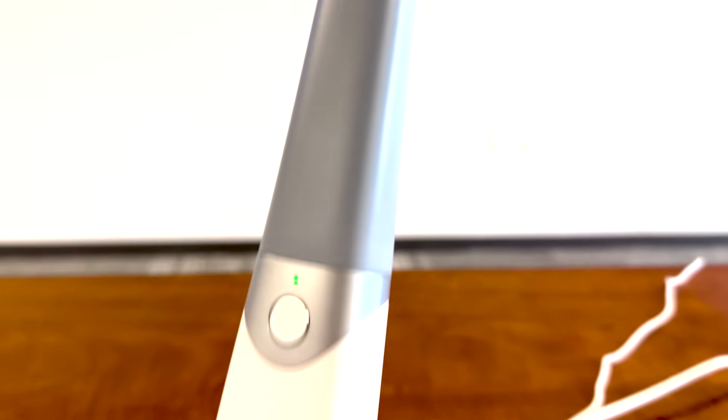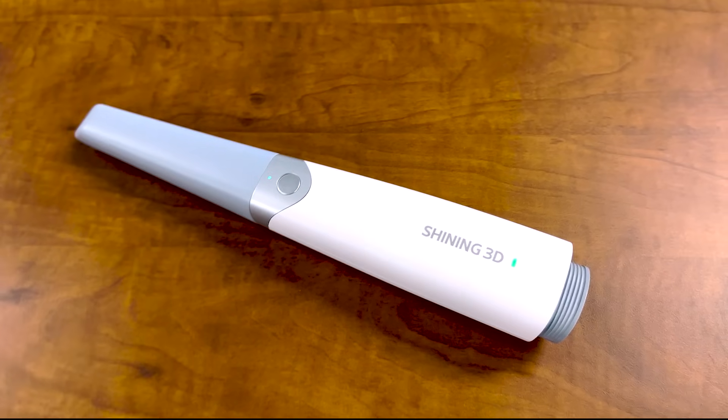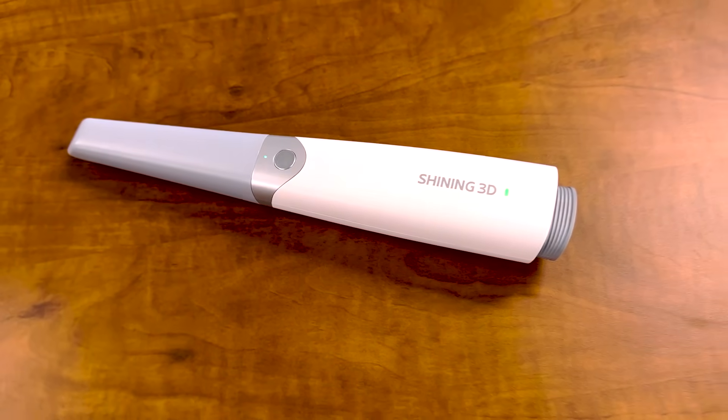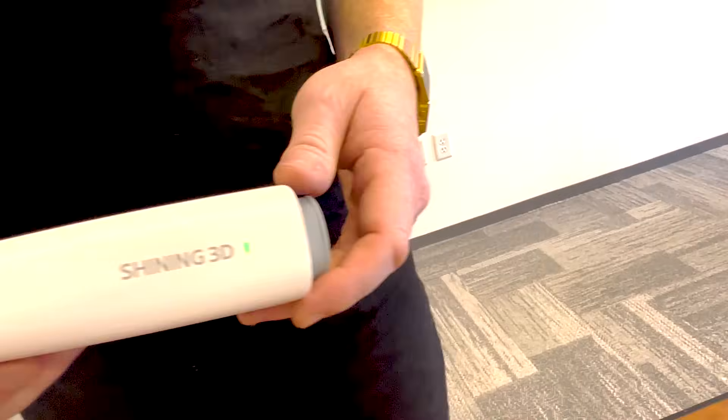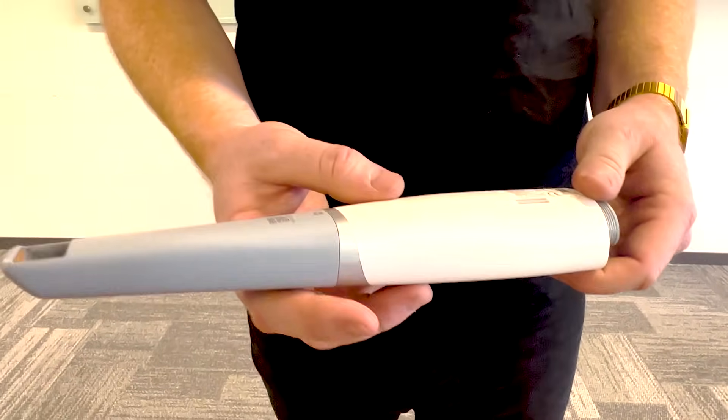This wireless intra-oral scanner from Shining3D comes with unlimited cloud storage for all of your patient scan data. The file output can be used in any major design software such as ExoCAD and 3Shape. It comes with three replacement batteries but also includes a wired option just in case of emergencies.